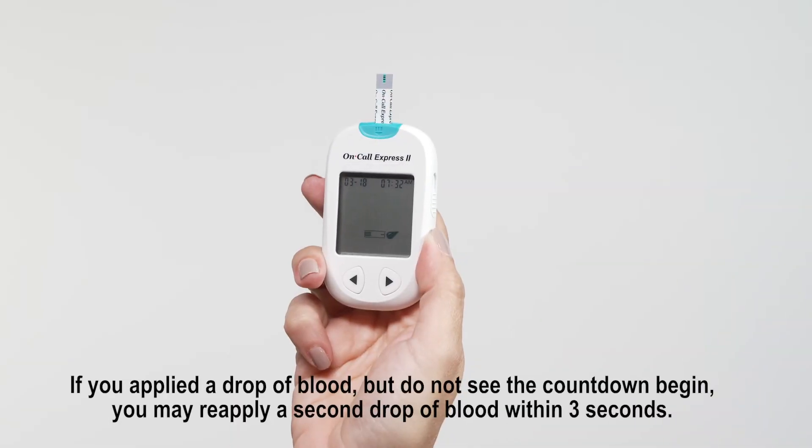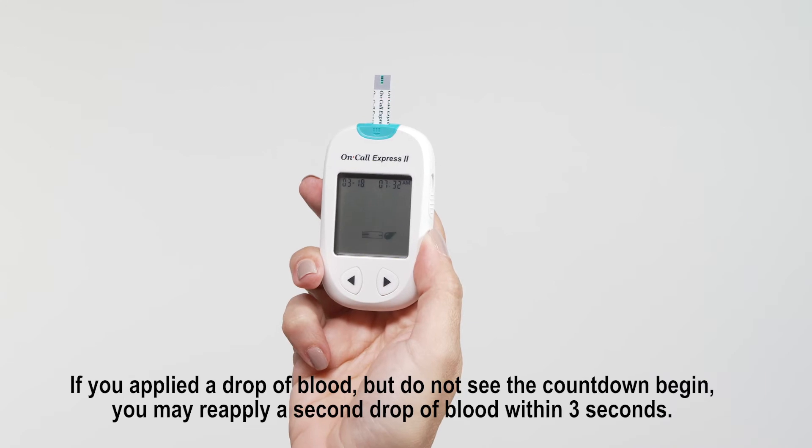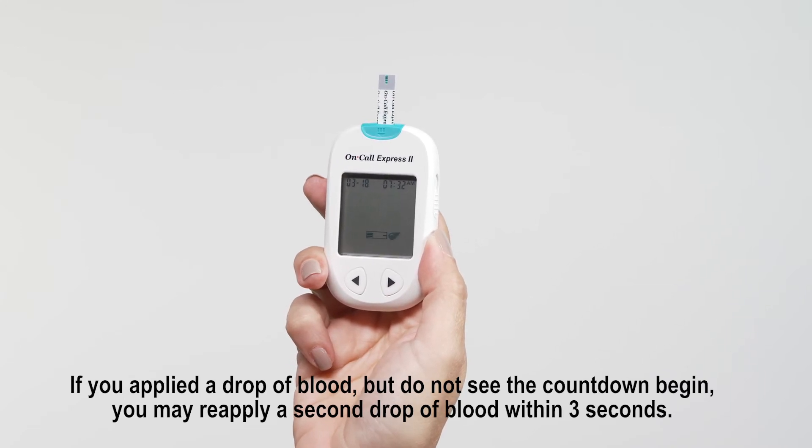The meter is ready for testing when the blinking blood drop and strip symbol appears. At this time a blood drop can be added.